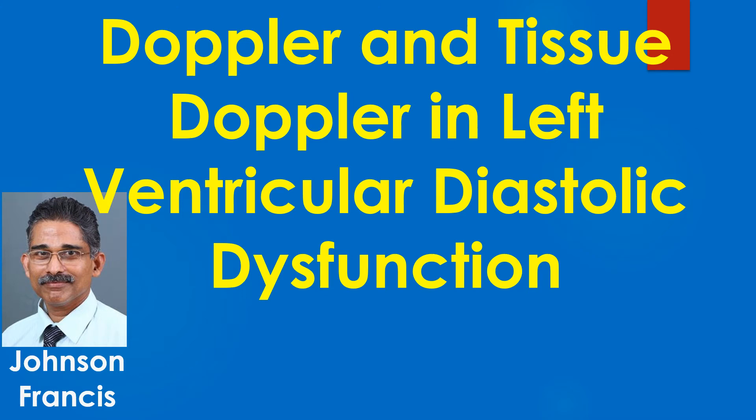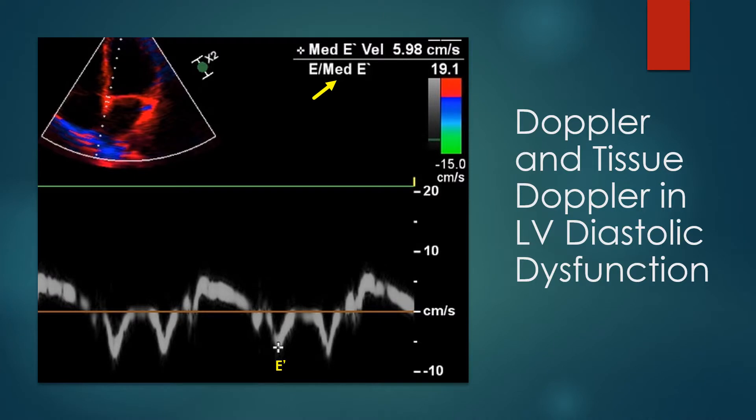Doppler and tissue Doppler in left ventricular diastolic dysfunction. This is a tissue Doppler image with colour kinesis in the inset. E by E prime of the medial mitral annulus is shown as 19.1, indicating left ventricular diastolic dysfunction.